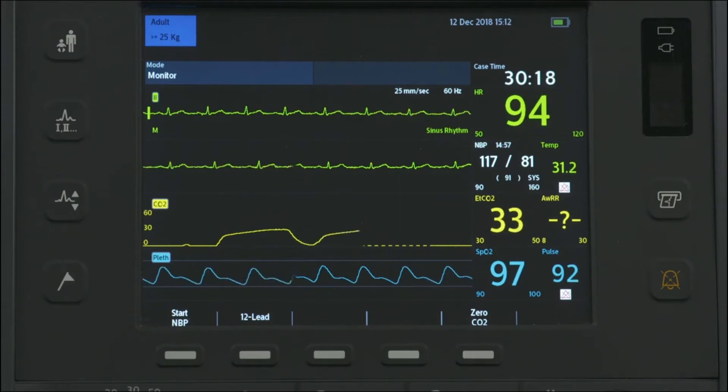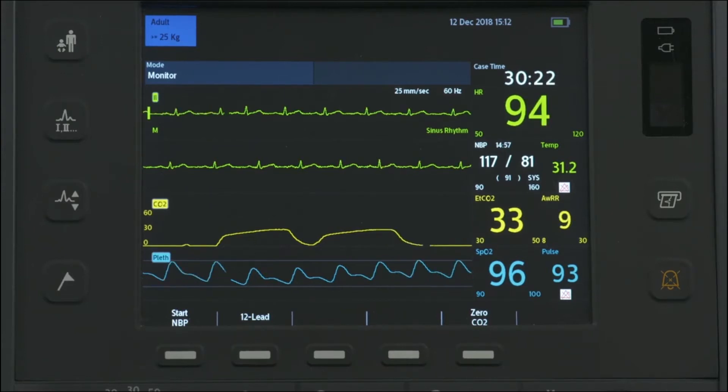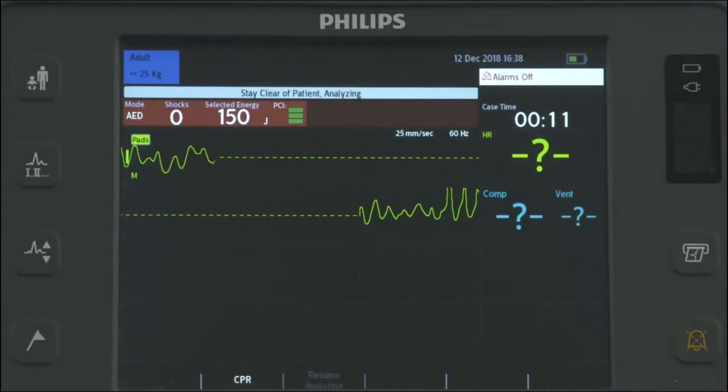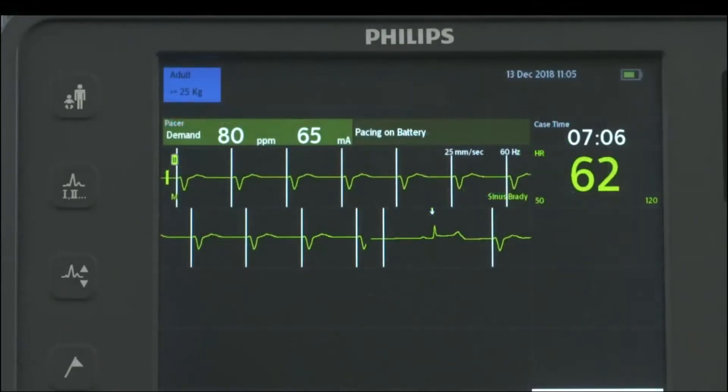The HeartStart Intrepid provides four clinical modes of operation: monitor, manual defibrillation, optional semi-automated external defibrillation, and optional pacing.